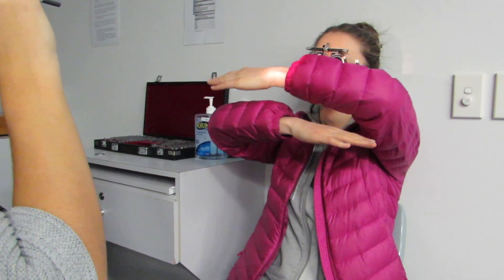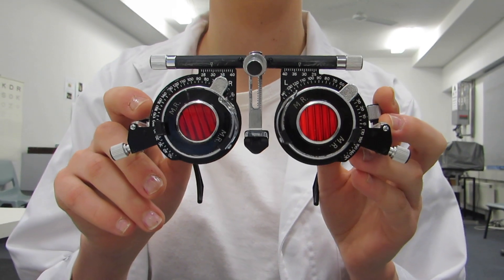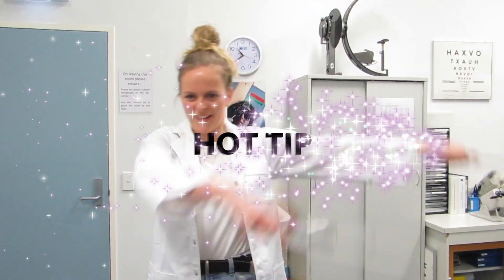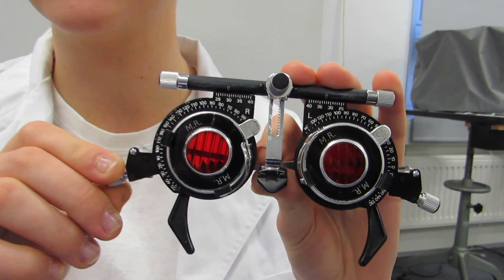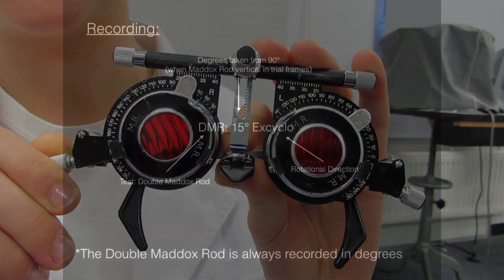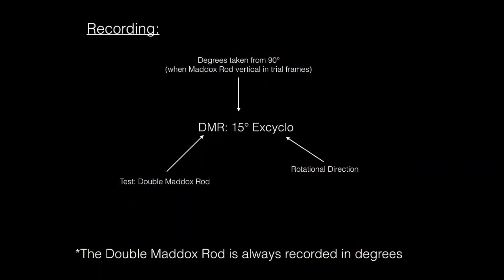After the patient adjusts the trial frames, the clinician asks them to show again with their arms where the lines are. Hot tip: remember you are recording the position of the eye, not the image. Starting at 90 degrees, rotating in towards the nose measures incycloduction and out towards the ear measures excycloduction. When recording your result, remember to list the name of the test as well as the amount and direction of reported torsion.